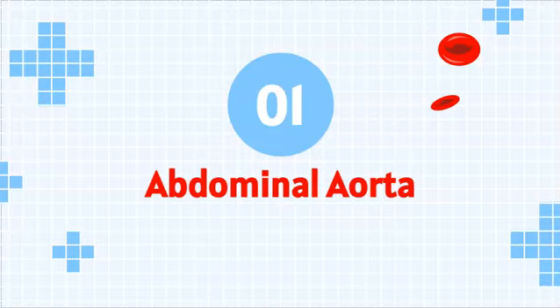The aorta enters the abdomen posteriorly and courses anteriorly as it progresses caudally. It is retroperitoneal and lies to the patient's left side, and it's also posterior to the pancreas. So why do we image the aorta? The main reason that we image the aorta is to screen for aneurysms or to monitor pre-existing aneurysms to make sure they aren't growing super rapid.